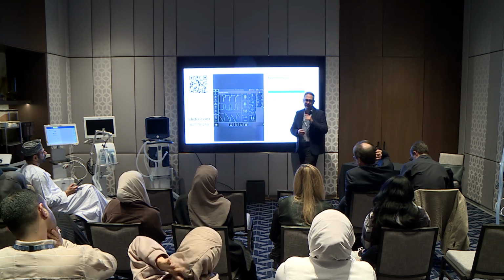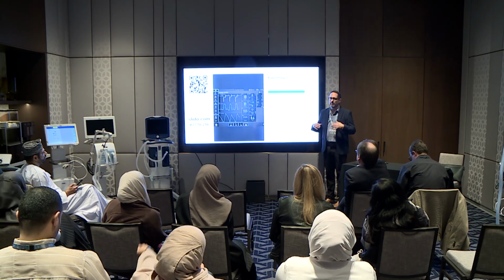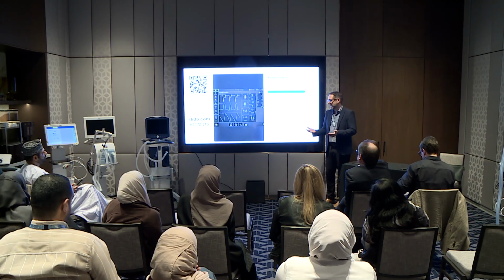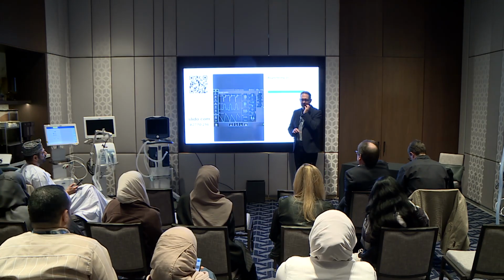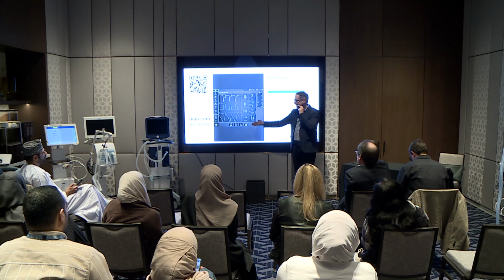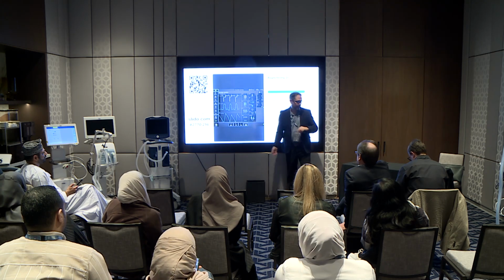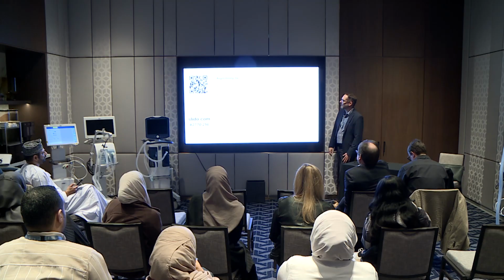I would just immediately switch to pressure and then try to see if you can give a pressure level that supports the patient without giving excess tidal volume. Again, if this patient was healthy, young, didn't have ARDS, I wouldn't be as concerned about the tidal volume per se, depending on how high it was, because they could still cause their own injury. But in this patient, clearly, I don't want to give them more tidal volume. They got it when I switched over. They're already getting more than I set. But yeah, switch to a pressure mode, which is what we did. Okay.